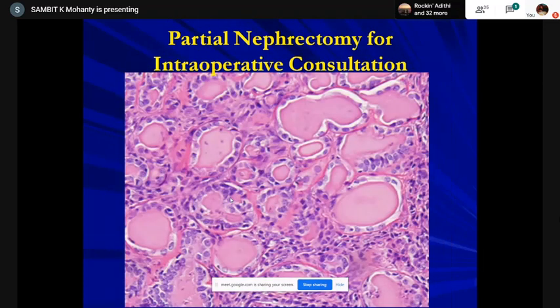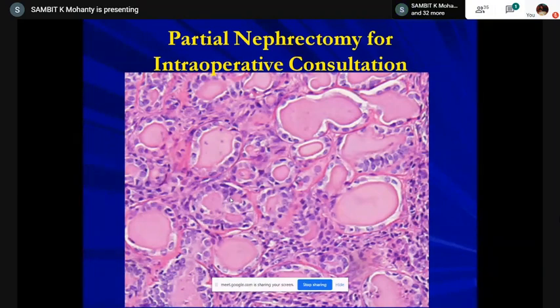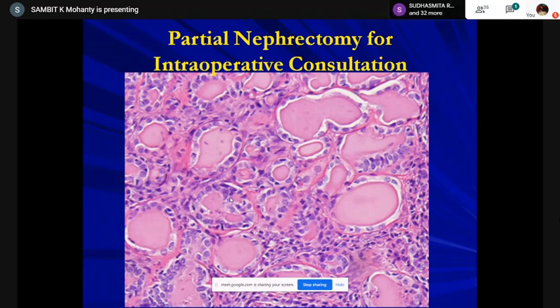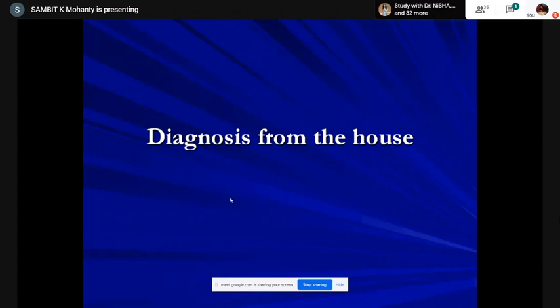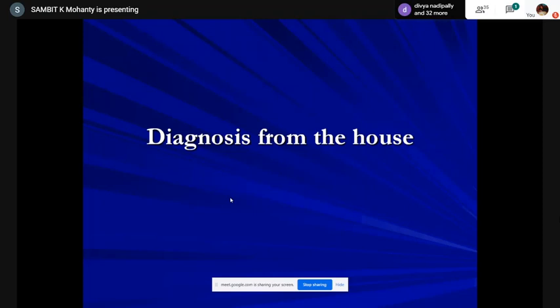The intraoperative frozen section slide looked like thyroid follicles — follicles lined by cuboidal cells. The NC ratio was maintained with mild increase in nuclear size, maybe with a small nucleolus. The question was: how do you deal with this kind of frozen section when the urologist is after you for a diagnosis and doesn't care much about the margin?